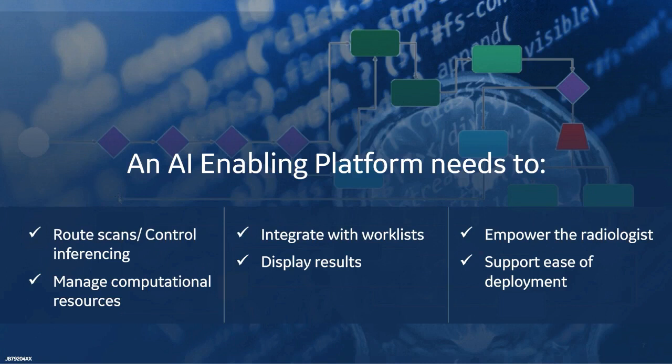And ask yourself the question, if an AI-based COVID detection algorithm were made available to you today, how would you implement this in your imaging workflows? And perhaps more importantly, how quickly could you implement it? The answer will most likely depend on whether or not your current PACS has a platform for rapid and easy onboarding of new clinical applications, and what changes are required to your current workflows to integrate those applications.